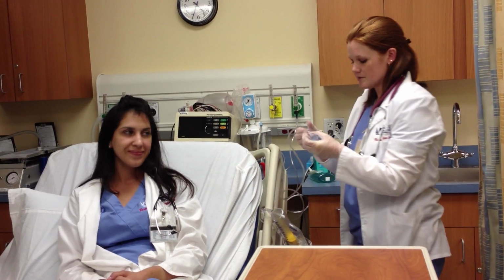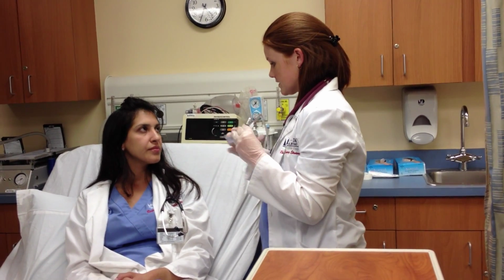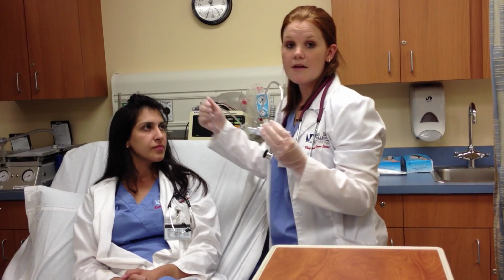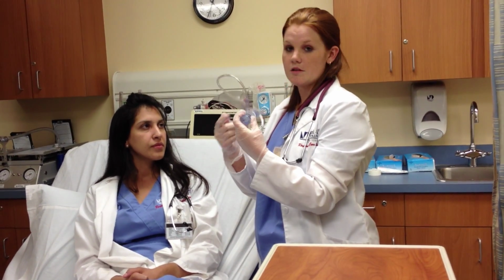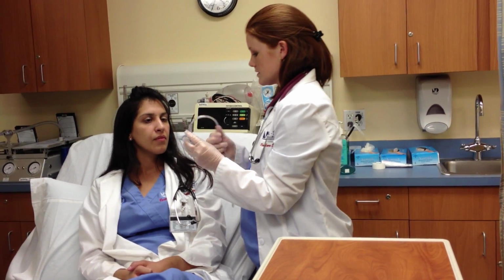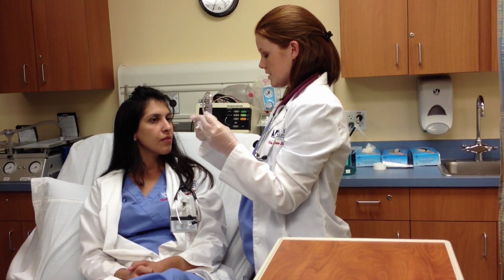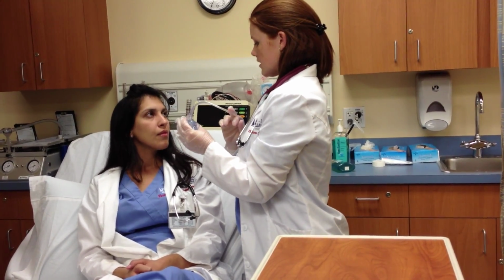I'm going to instruct my patient to take a deep breath, not all the way, and then exhale slowly. Normally you would have a nose clip during this procedure if your patient cannot control her breathing strictly through the tube through her mouth. So once I place this in your mouth, make sure your lips form a nice seal. Inhale and exhale slowly.